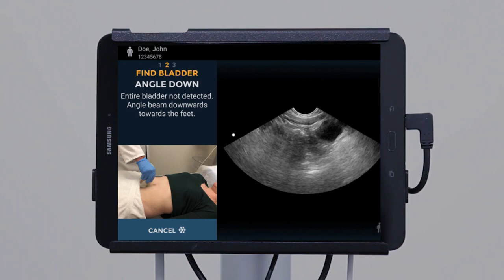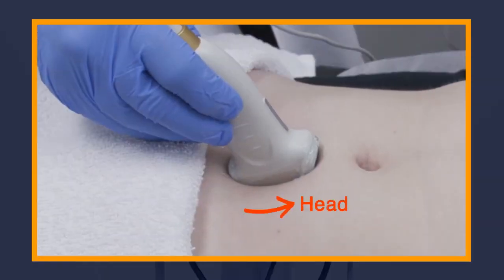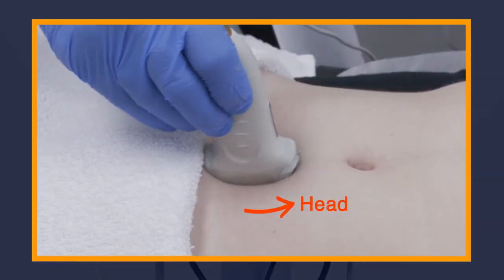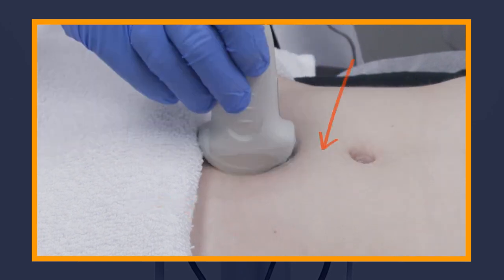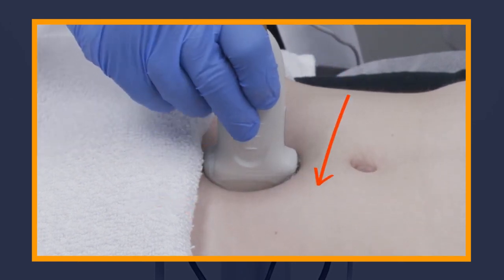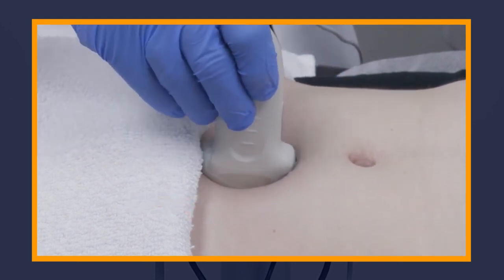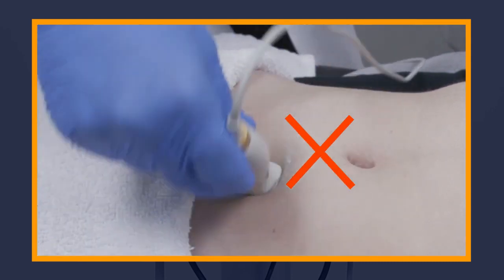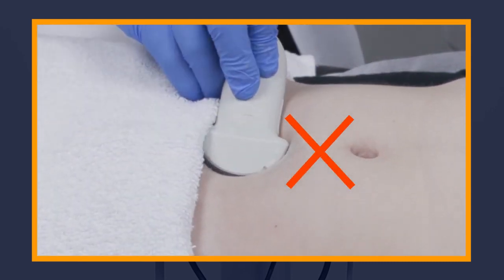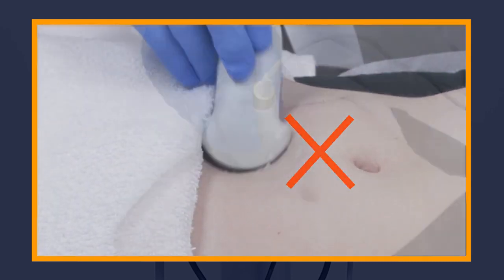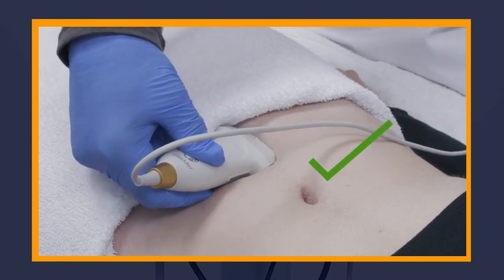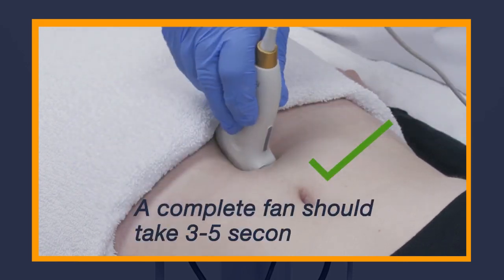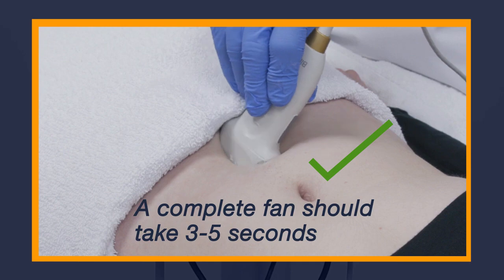If the bladder is not found right away, the system may prompt you to re-angle the probe towards the patient's head or down towards the patient's feet. It may also prompt you to apply firmer pressure or more gel. Additionally, do not fan too fast or too slow. Maintain consistent pace and pressure during the scan. As a guideline, a complete fan should take around three to five seconds.